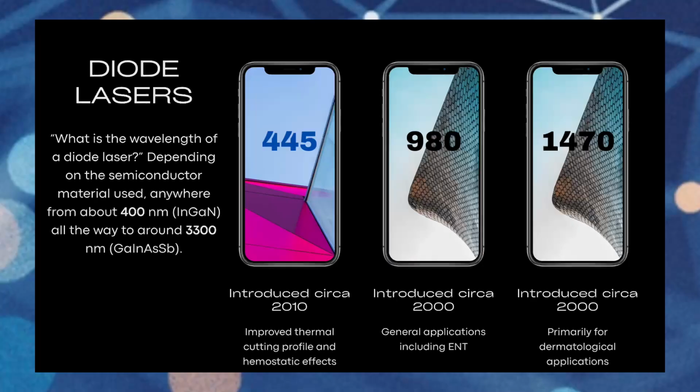Of course, in most Western or EU countries, you have systems where the number of times that the fiber is used is clocked in a chip connected to the attachment hub, and it shuts you off after 10 uses, and you have to buy a new fiber, even though the fiber is completely usable.